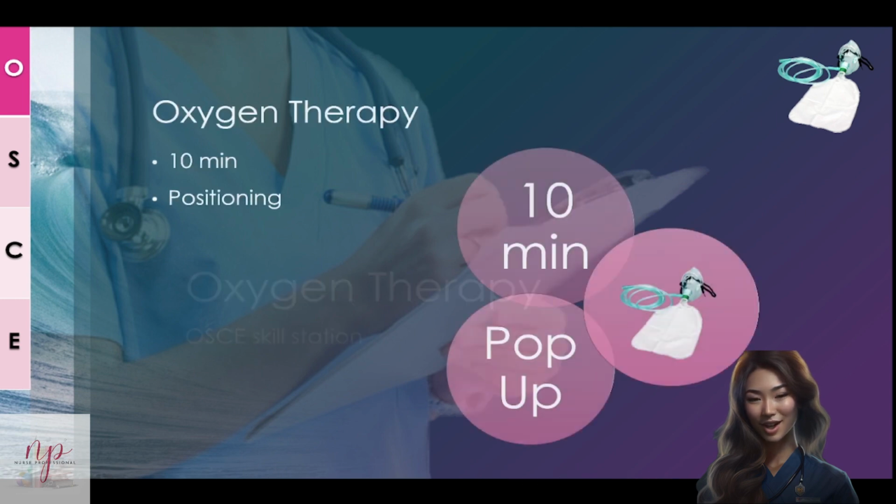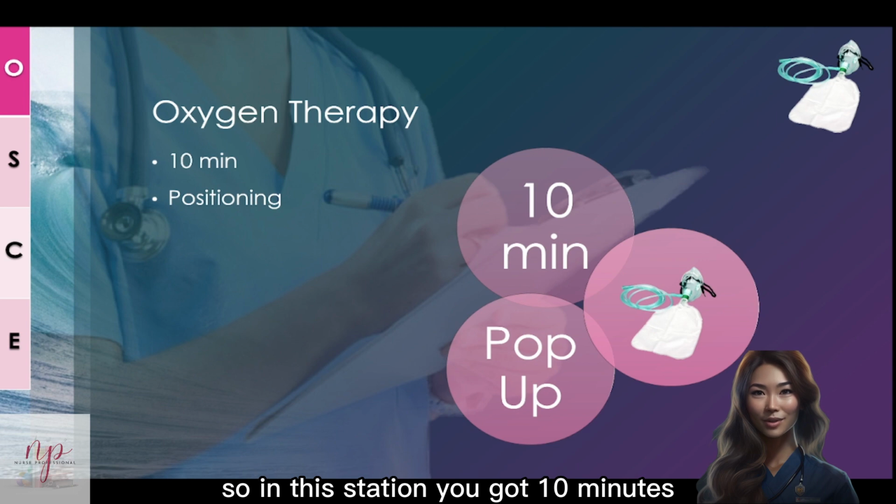Alright? So in this station, you got 10 minutes. And again, positioning is very important. Make sure you pop up your patient.